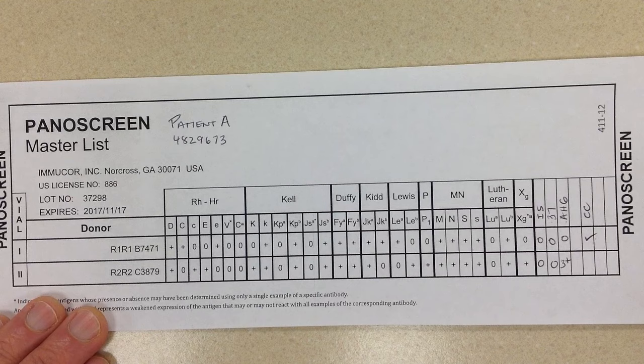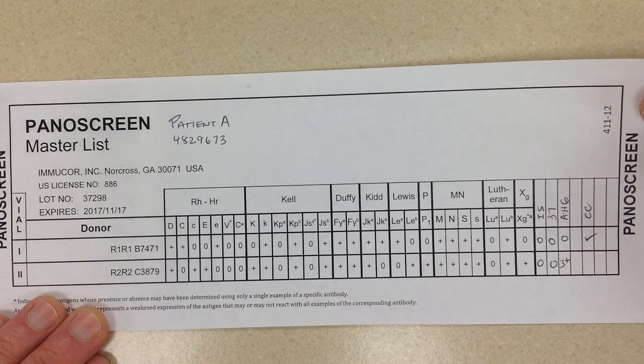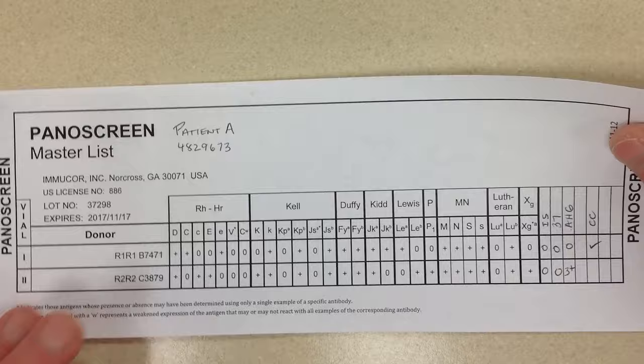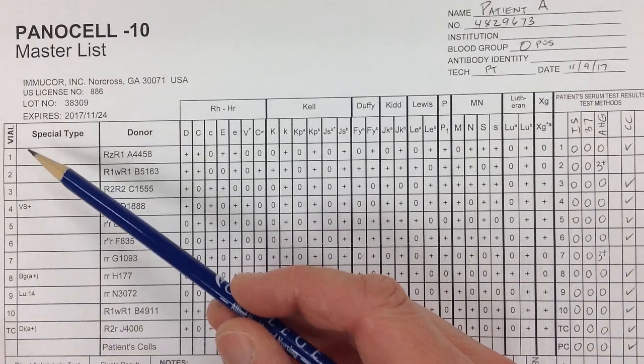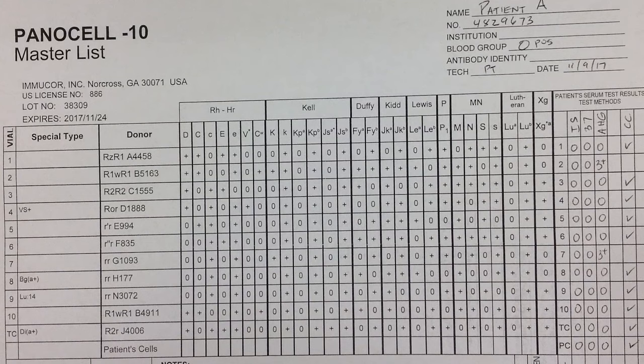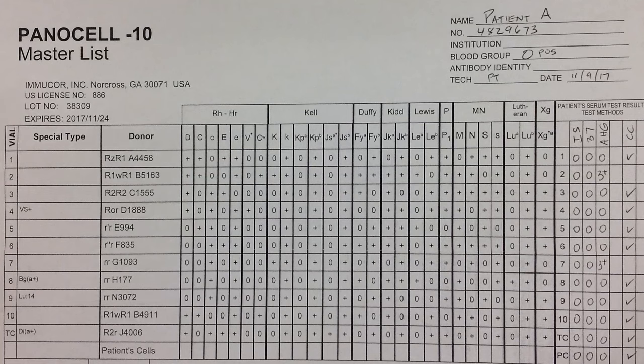If a patient has a positive screen, as this patient does, then more than likely an antibody identification panel is going to be done. As I mentioned, the screen only has two vials. If we take a look at our identification panel, we can see that on the left we have our vials — one through ten — and then TC, which is technical cells, which we're going to basically treat as the 11th vial. This particular piece of paper with the antigen profile is also called an antigram.